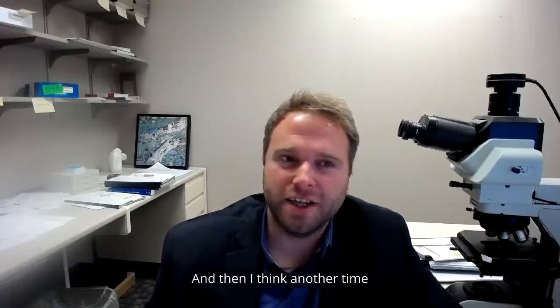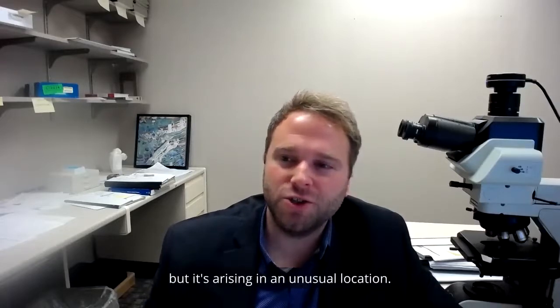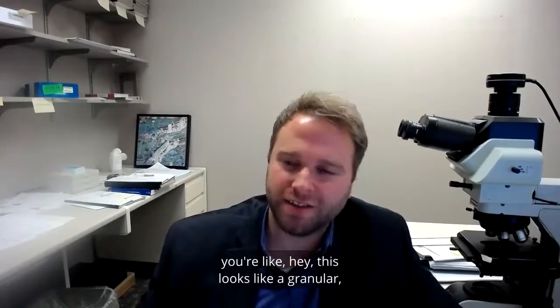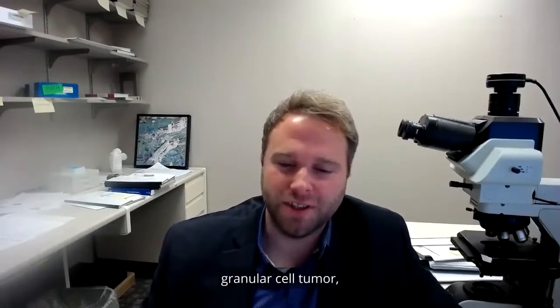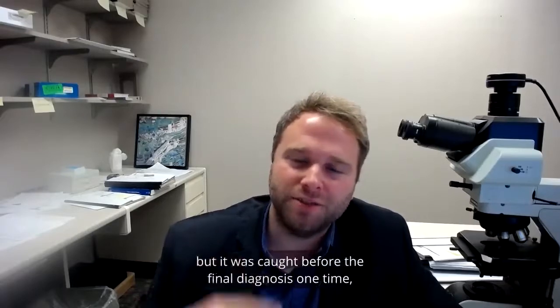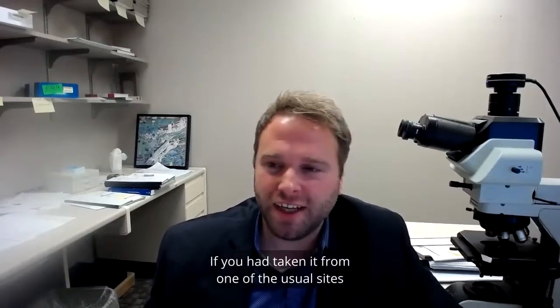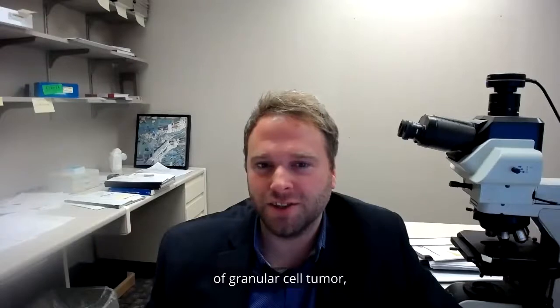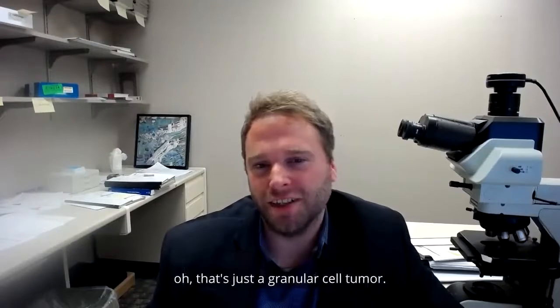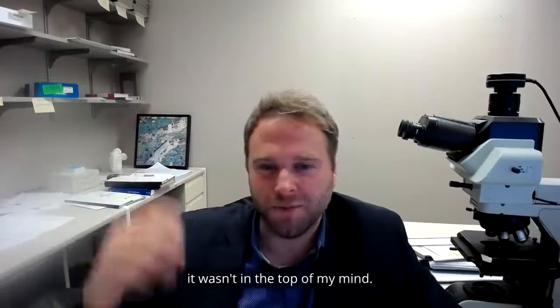And then I think another time where things become challenging is where it may not be a rare entity, but it's arising in an unusual location. So sometimes it's more just thinking outside the box. You're like, hey, this looks like a granular cell tumor, just as a random example. I sort of miscategorized one, but it was caught before the final diagnosis because it was in an unusual location. If you had taken it from one of the usual sites of granular cell tumor, like the oral cavity or the esophagus, I would have easily said, oh, that's just a granular cell tumor. But because it was an unusual location, it wasn't at the top of my mind.